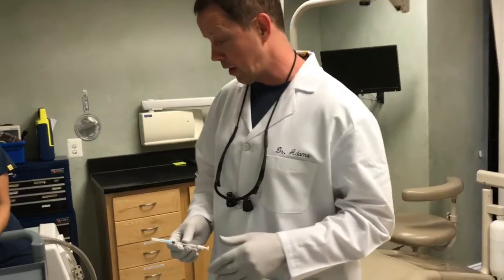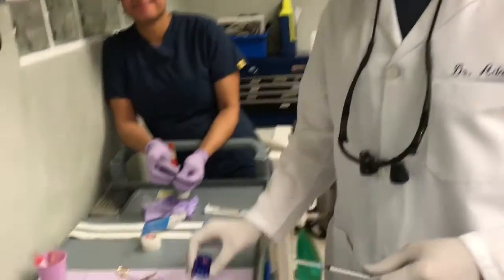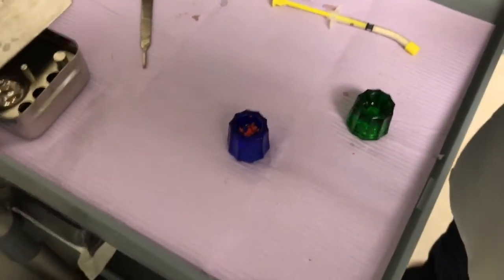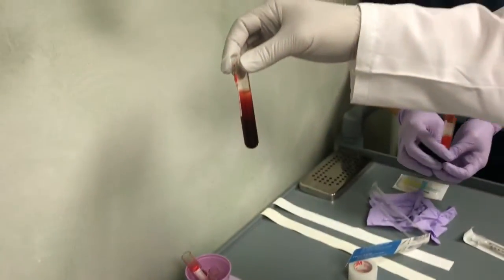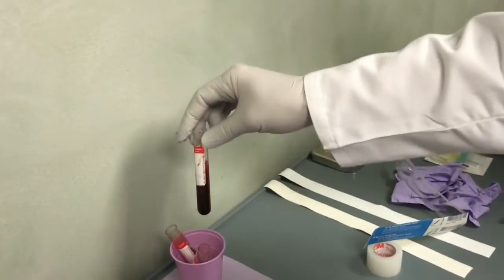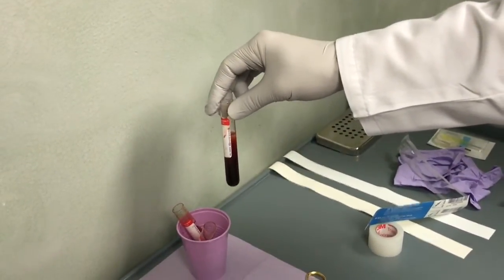The platelets come from the patient's own blood. We draw the blood here in our office and spin it in our centrifuge to get different formulations. This is a mixture we've already prepared — basically we've taken vials of blood and spun them in a centrifuge to get what we call PRF, platelet-rich fibrin.